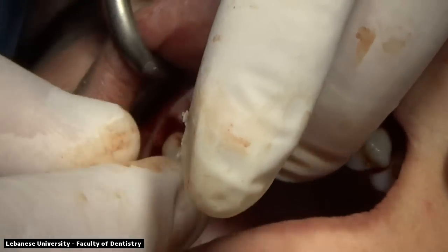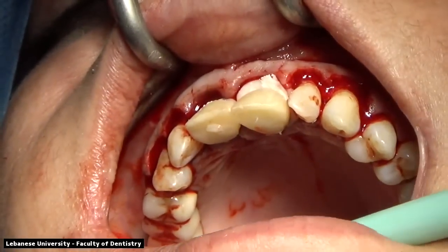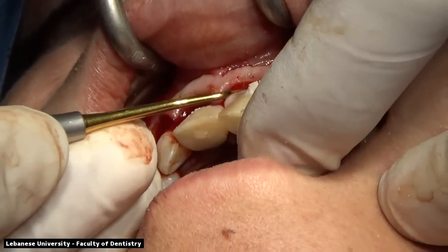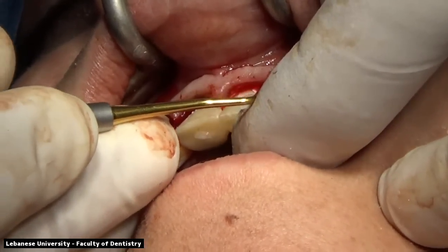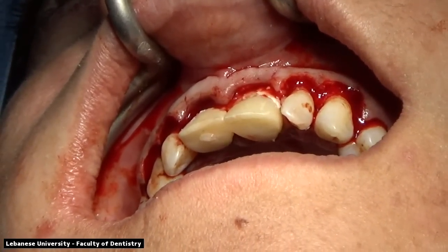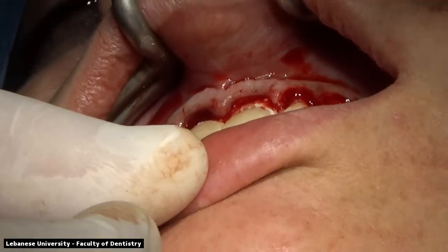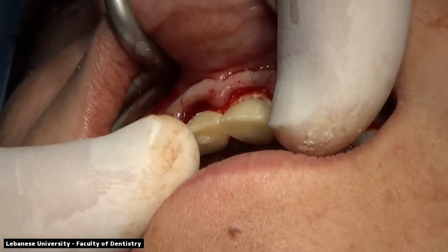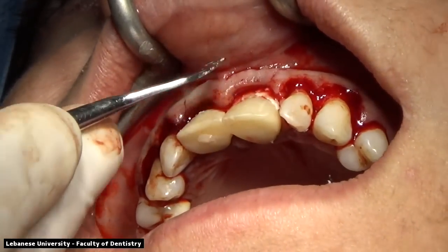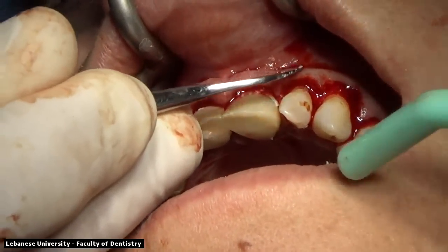We're placing our temporary restorations, placing some pressure on the abutment teeth, and the excess will be removed. We do have an opening from the lingual side which will remove the excess acrylic material, and we're adapting the acrylic material to the abutment surface so that it's flush to the abutment surface with no gaps or no possibility for plaque retention and for leakage of bacteria. This will help in adaptation of the soft tissue and better emergence profile of the soft tissue. It's very important for it to be flush with the abutment, with no gaps and with no ledges or protuberances on the acrylic material. So we don't want any ledges.